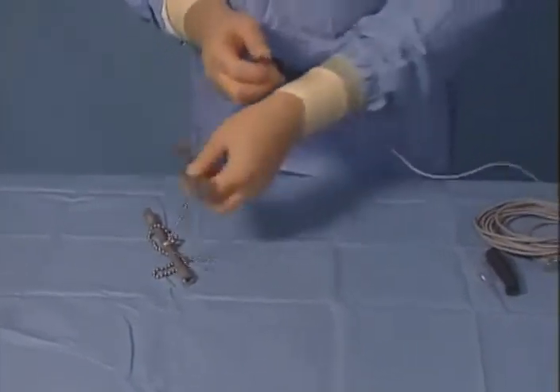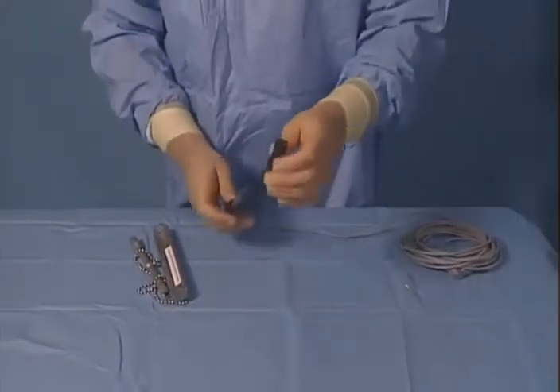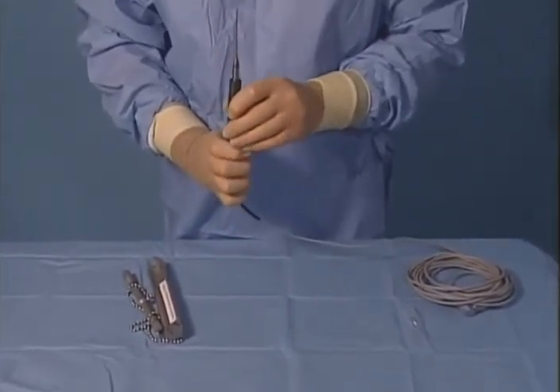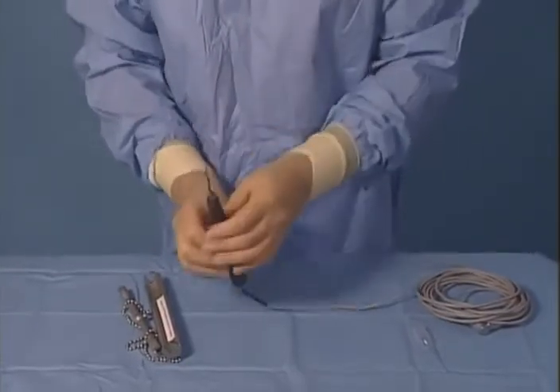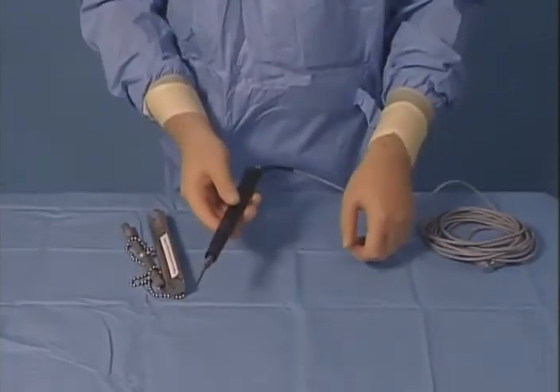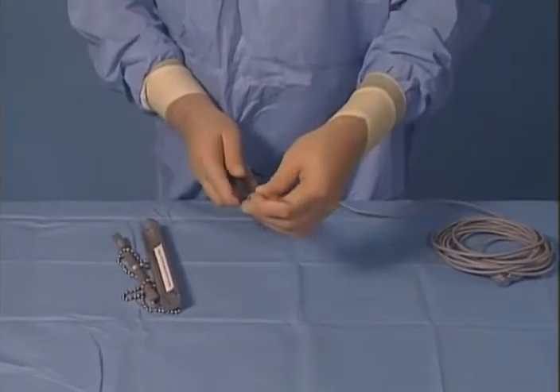Remove the handpiece from the holder and attach the black shroud onto the handpiece, ensuring that the shroud is centered and aligned with the silver angled extension. Warning: failure to center the shroud may lead to overheating of the handpiece due to improper alignment. Attach the clear flue by firmly pushing into the shroud until completely placed in position.